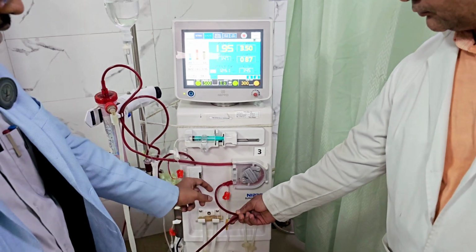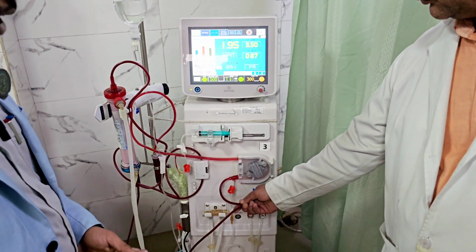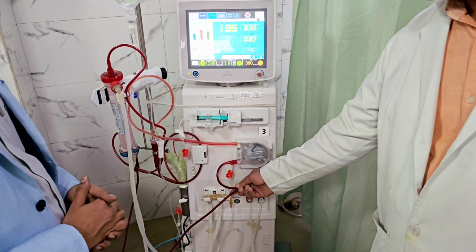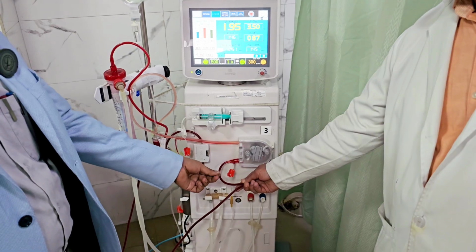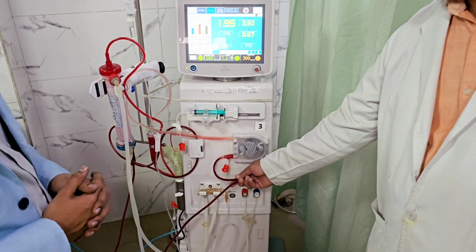If we close this tube like this, ideally a glove has to be used. If it is closed like this, you can see the circuit is getting diluted with normal saline. We can do it without closing the circuit also, but if we close it, the effective dilution will be better.